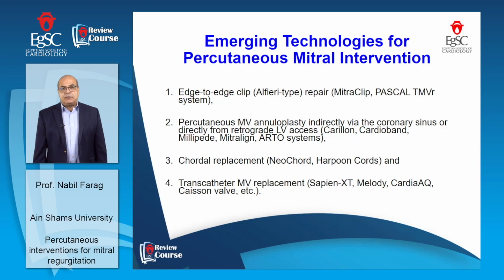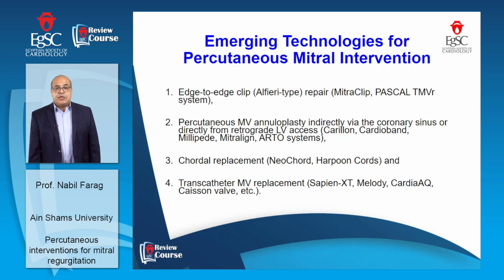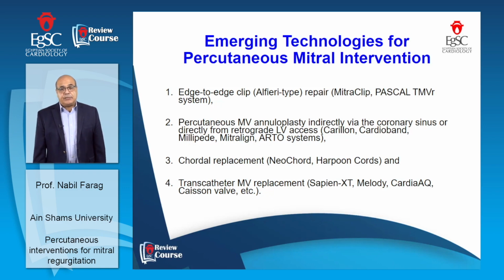What about the emerging technologies for percutaneous mitral valve intervention? We mentioned mitral repair using the clip, or MitraClip. Now it is one of the techniques established all over the world. Other technologies, in addition to the edge-to-edge clip based on Alfieri-type repair, include some advancement and development in the MitraClip itself, and we have the PASCAL transcatheter mitral valve repair system. This is also a new device used to repair the mitral valve in case of severe functional mitral regurgitation.